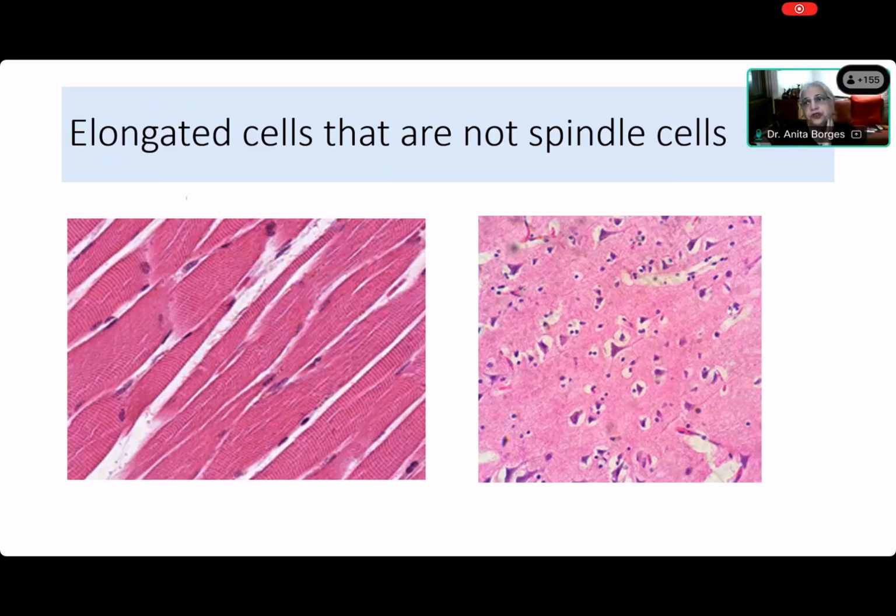Why are they not spindle cells? We do not refer to striated muscle, skeletal muscle, as a spindle cell. It's an elongated cell, so long that we call it a muscle fiber. Where are the nuclei of these muscle cells, Shashank? You can see the nuclei of the muscle cells. They are there, but at the periphery. All skeletal muscle cell nuclei are at the periphery. So strictly speaking, although these cells are elongated and do have spindle nuclei, they are not referred to in common everyday pathology literature as being spindle cells.